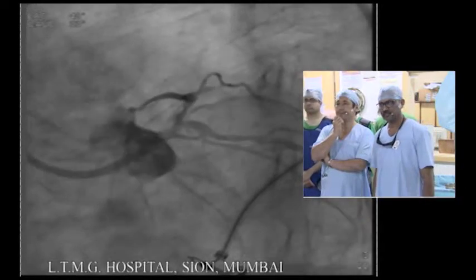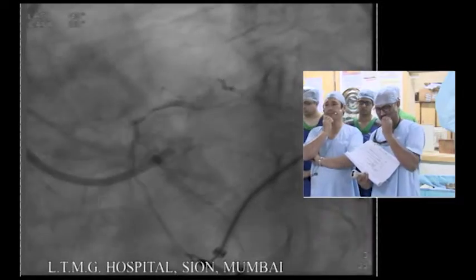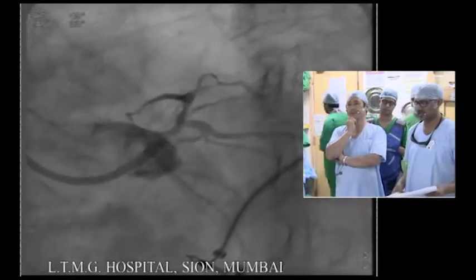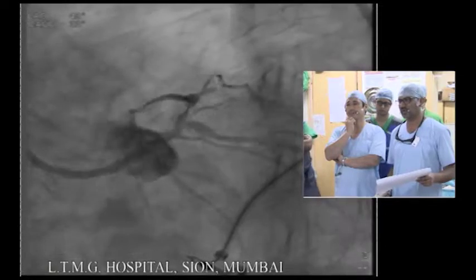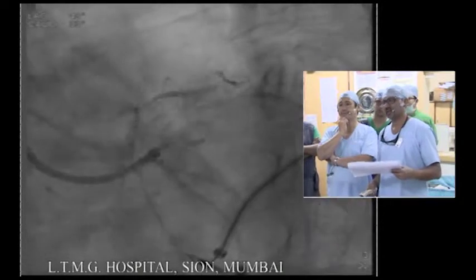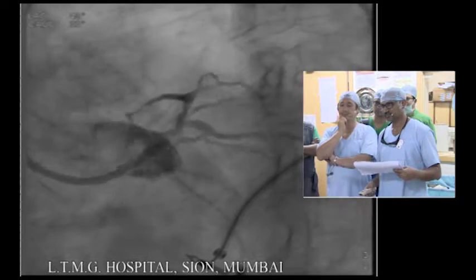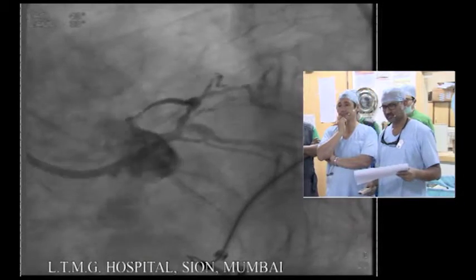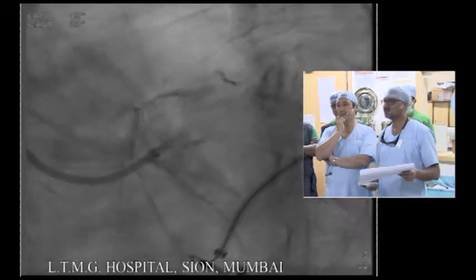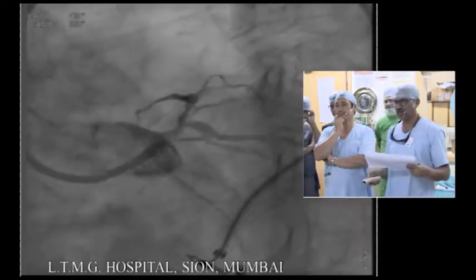Question: why do you use the femoral approach? The thing is that she is a female, and she had undergone angiogram by radial only. Now the radial is slightly weak and we want to do a bifurcation strategy, so we have to use the 7F guiding. Because of that we had to use the femoral. So what is the opinion of the house?